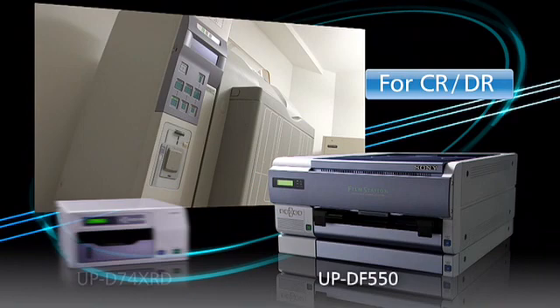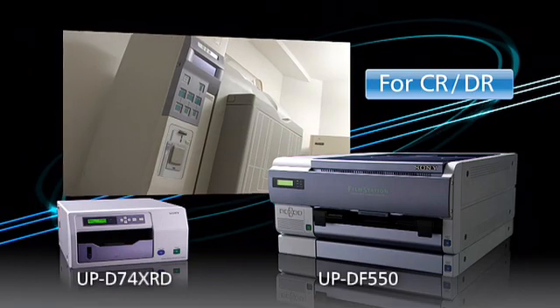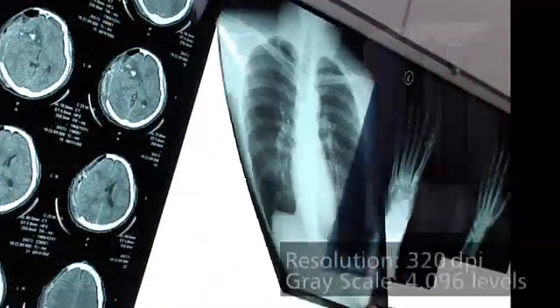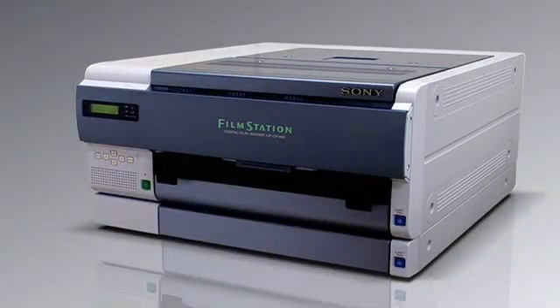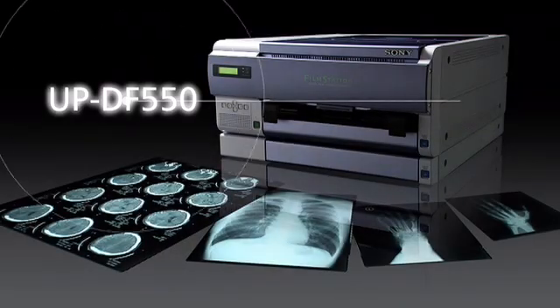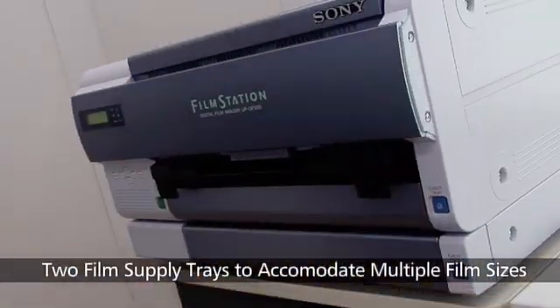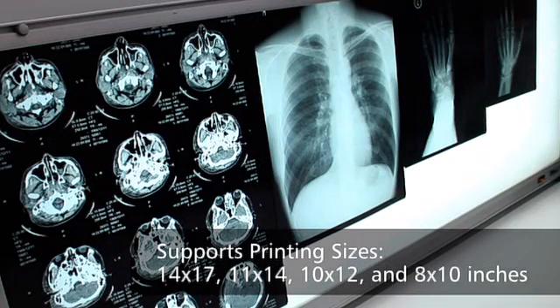Furthermore, for CR and DR, Sony offers the UPDF550 and UPD74XRD. Just like the UPDF500, the UPDF550 is a 320 dpi, 4096 grayscale digital film imager that produces high quality images for diagnosis and can be placed either horizontally or vertically. Even though its compact size is almost the same as the UPDF500, the UPDF550 is equipped with two film trays and supports printing in four different sizes: 14 by 17, 11 by 14, 10 by 12, and 8 by 10 inches.